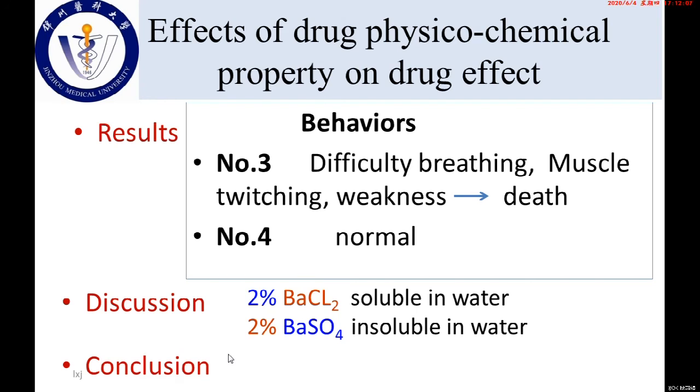But number 4, this mouse was administered barium sulfate. It's normal. It is like before administration of the drug. The mouse number 4 has no change. This is the result. Why?